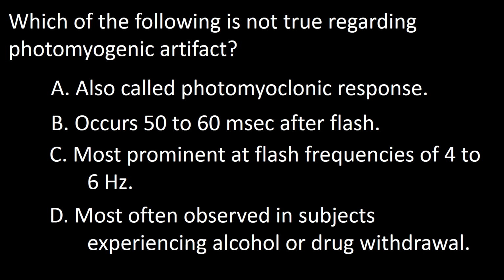Next question. Which of the following is not true regarding photomyogenic artifacts? A, also called photomyoclonic response. B, occurs 50 to 60 milliseconds after the flash. C, most prominent at flash frequency of 4 to 6 Hz. D, most often observed in subjects experiencing alcohol or drug withdrawal.